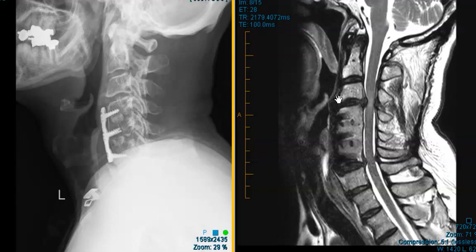This is an x-ray on the left and this is the MRI on the right. About 12 years ago they did this fusion. We see an anterior fixation plate, and these screws are going into these vertebral bodies. This is from C4 through C7.